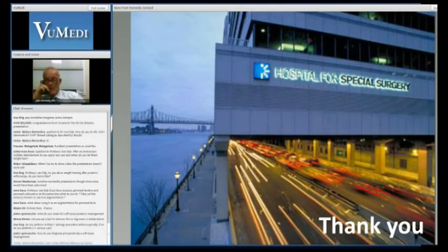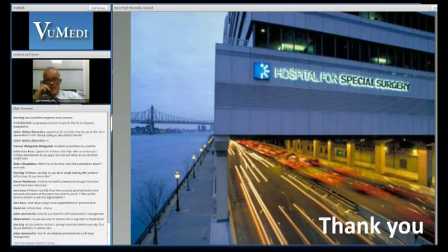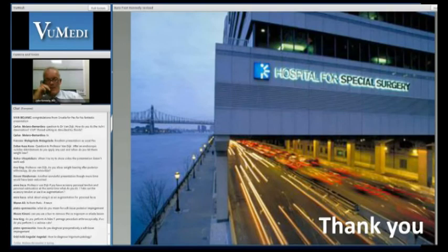One of the things that we've been doing is using peroneal tendoscopy, posterior tibial tendoscopy, and Achilles tendoscopy, and not just doing a denervation that Nick talks about, but actually looking for the pathology within the tendon when we can find it, and debriding the tendon, and at the same time introducing a biologic from the patient, typically PRP, into that area. So I think that adds an adjunct to the mechanical aspect by introducing a biological, and we have good data now going back 3 years, and hopefully we'll be publishing that soon.